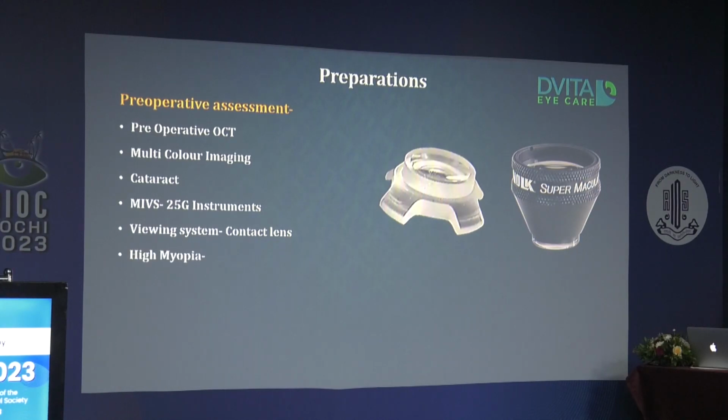Third, in high myopia, if a patient has high myopia with an epiretinal membrane, choosing the instrument is difficult and important.